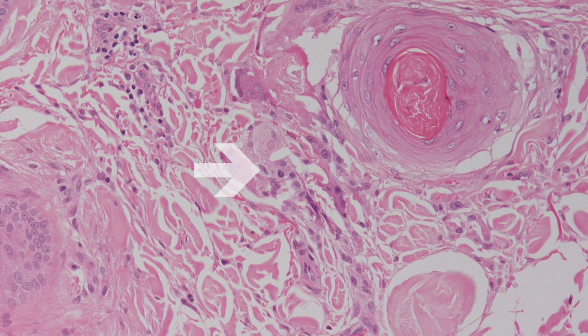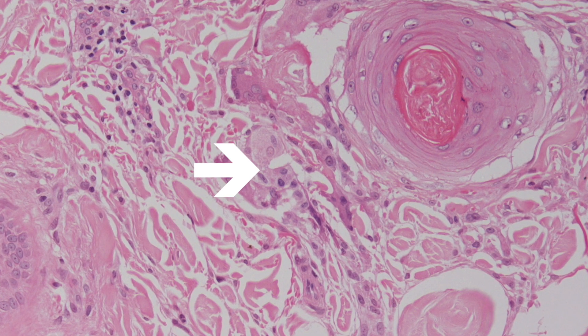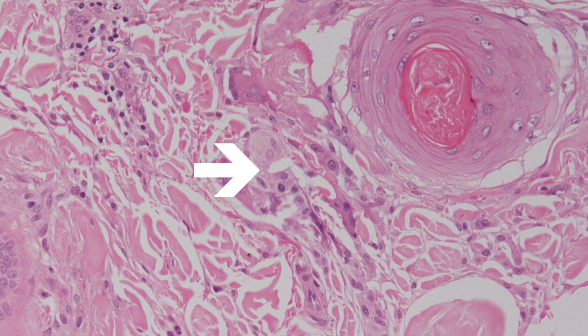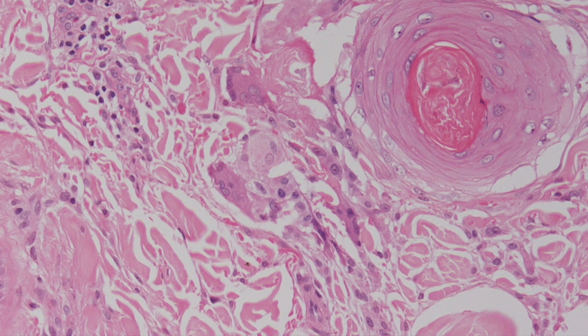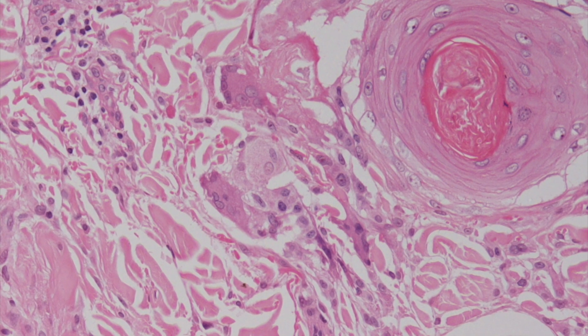And finally, here is a collection of foreign body type giant cells adjacent to a horn cyst that has ruptured.